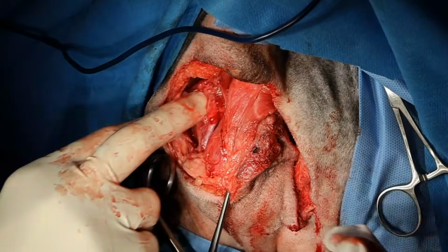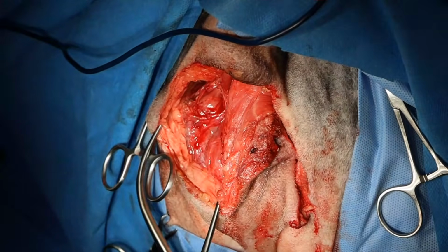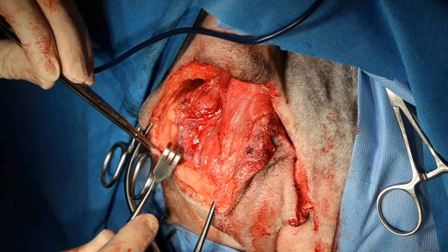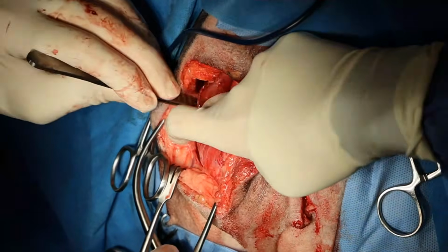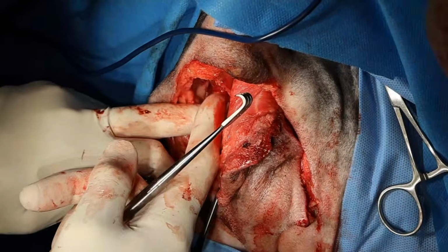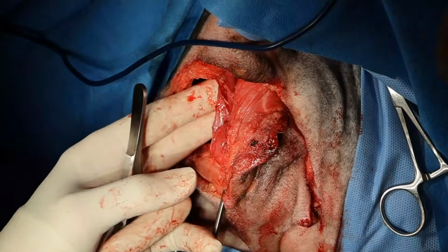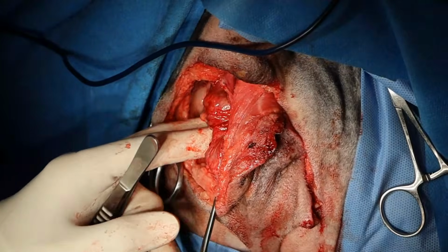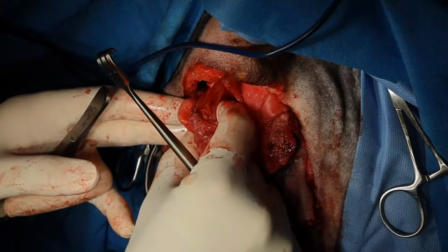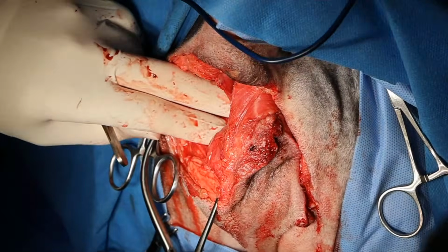Okay, so now we're going to tuck that other side of the hernia back in here. Dissect ventrally here to get to my ischiatic table is right there, anal sphincter is there, and coccygeus is right there. I would love for this to get tucked in a little bit better. That feels suspiciously like urethra and prostate. You feel the tube-like structure? Yeah, so that feels like prostate. So you could easily look at that and say, oh, that's a cryptorchid testicle. I'm going to castrate him. And we already got 2 testicles.